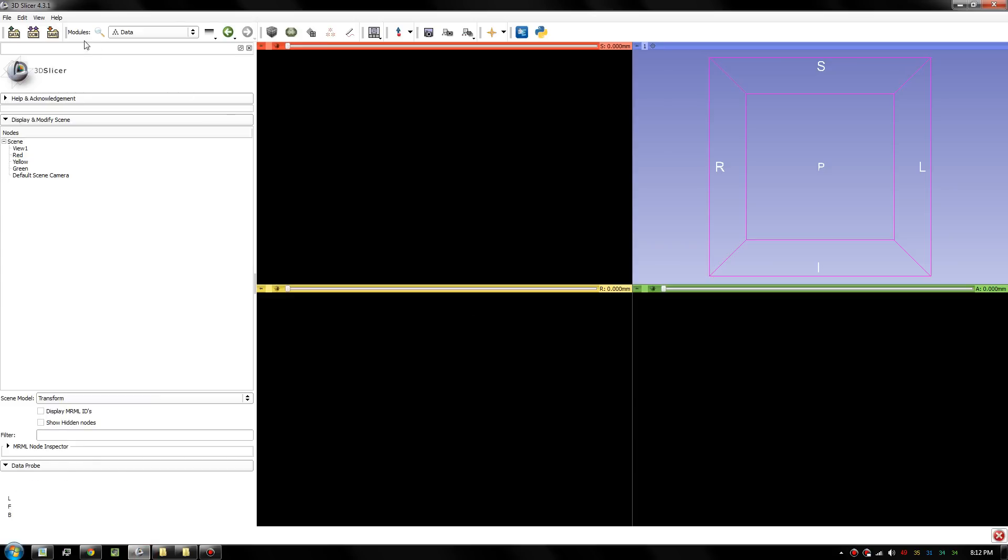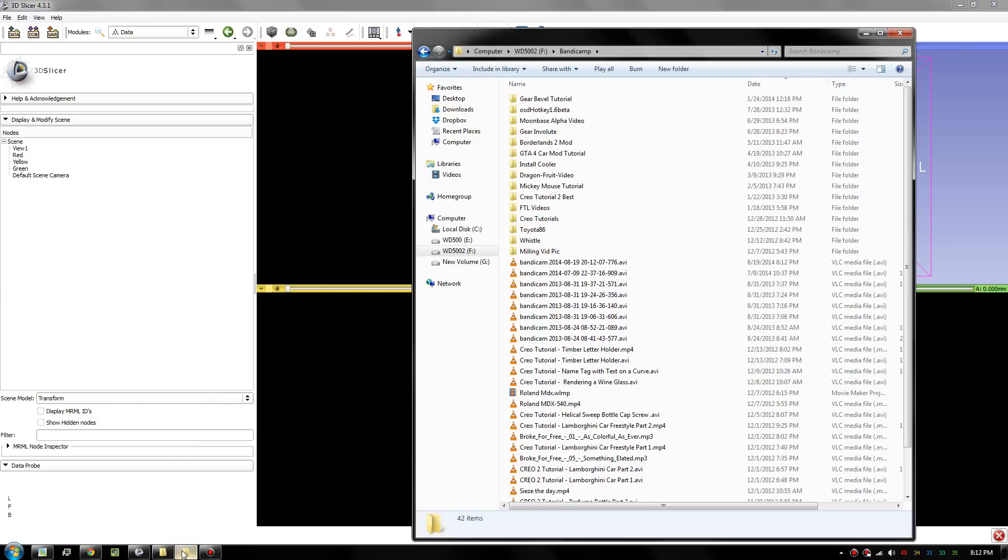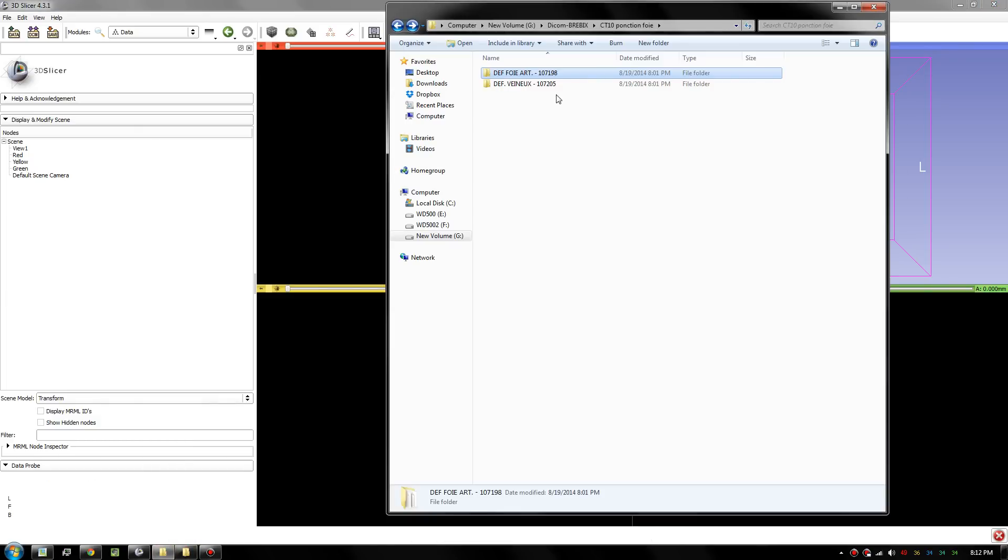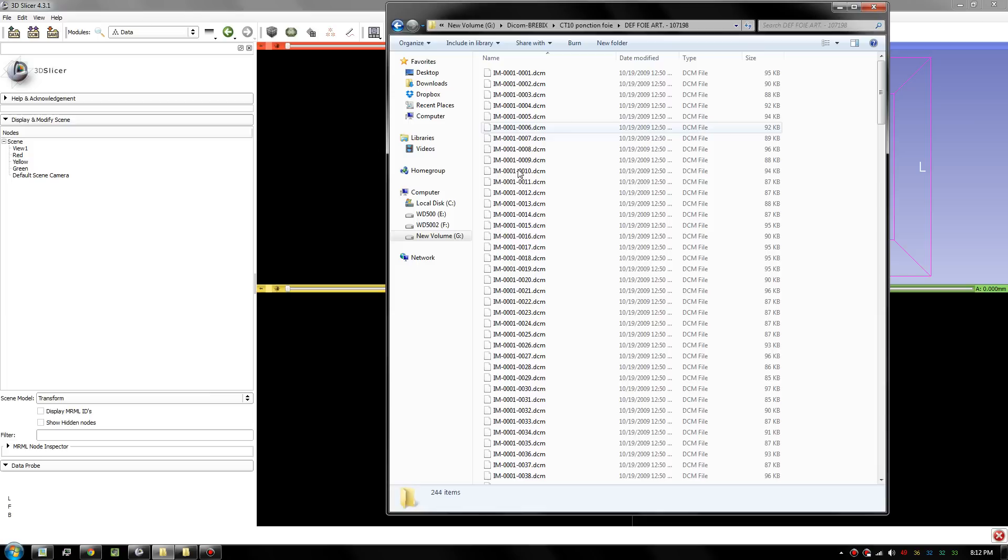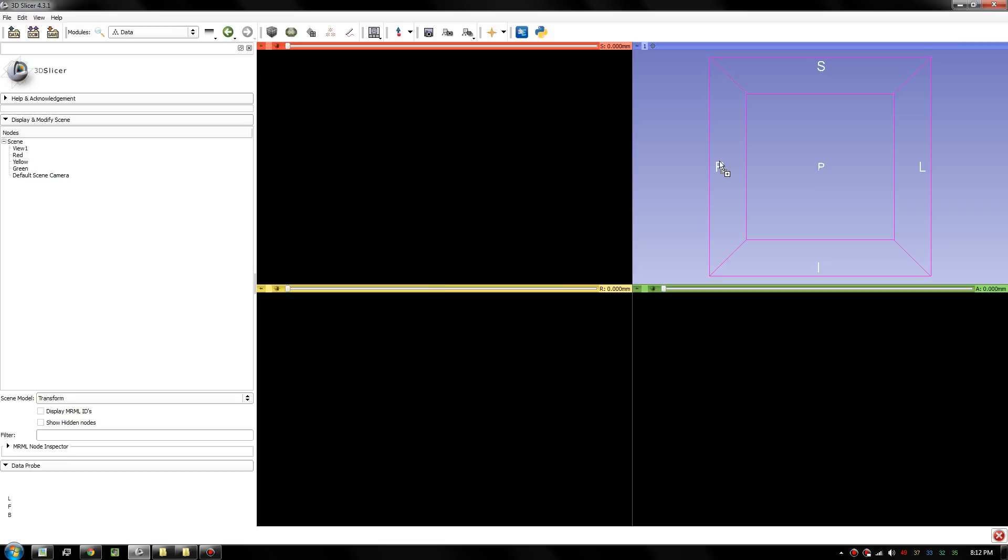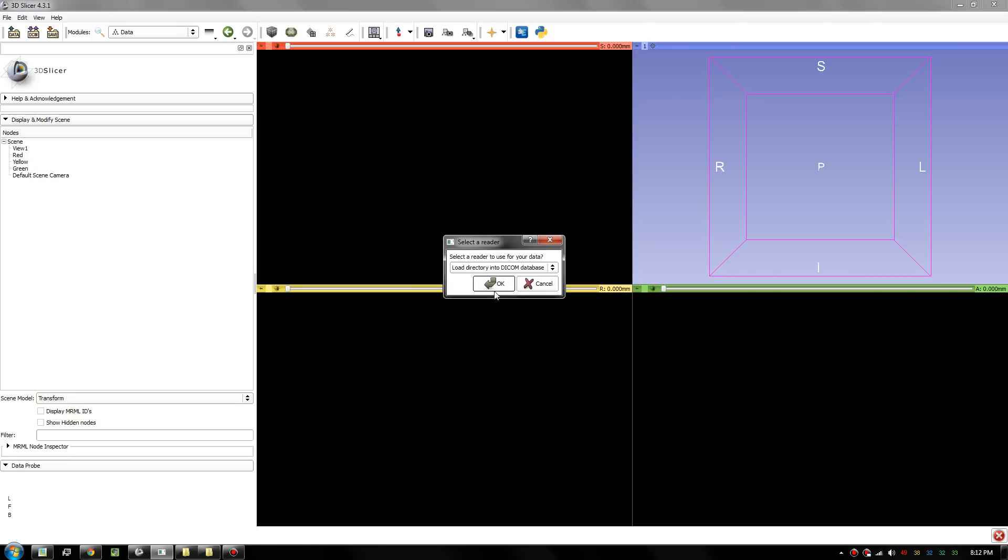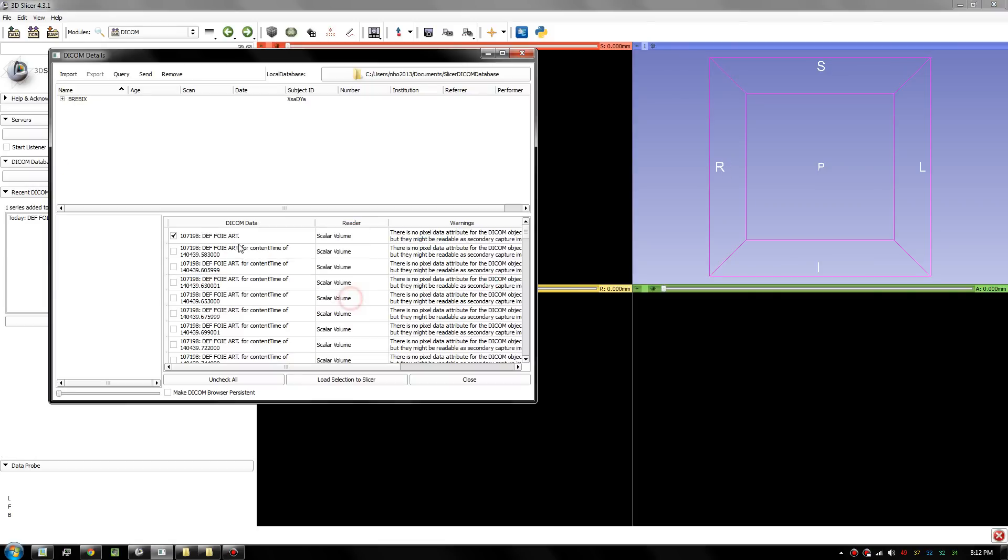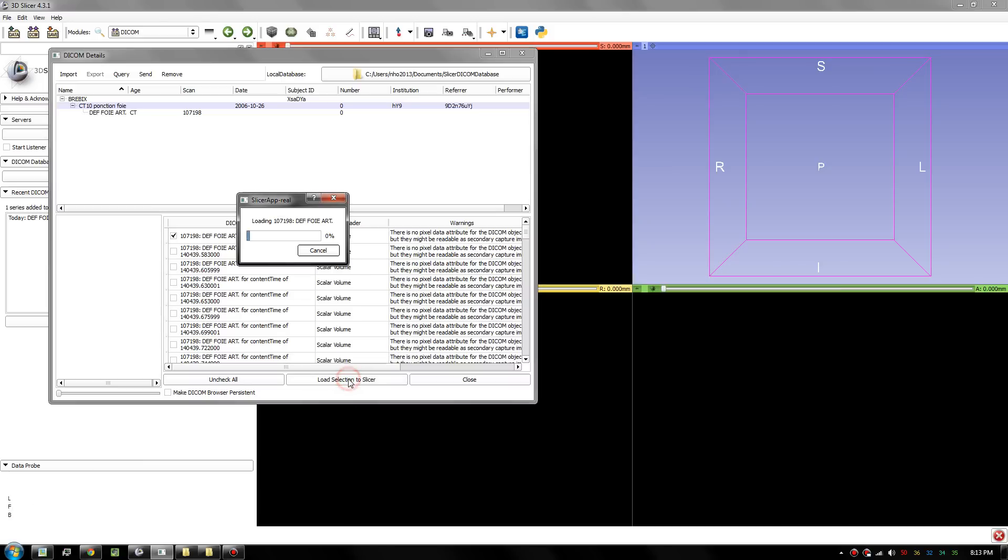We have this program called 3DSlicer and it can open DICOM files. DICOM files are scan slices of a person, an MRI scan, and you simply drag it into the software. Just open this up, select the data, and load the selection into the slicer.